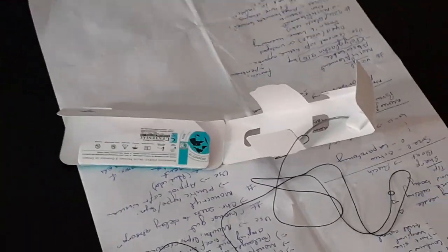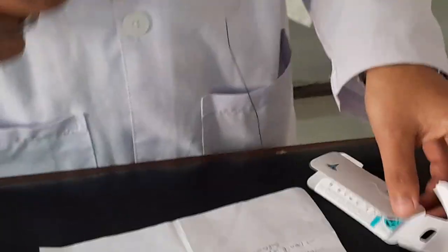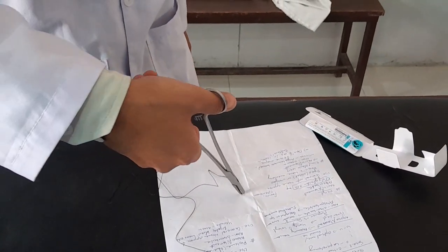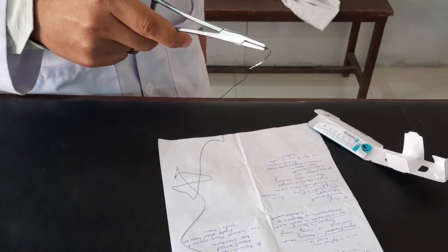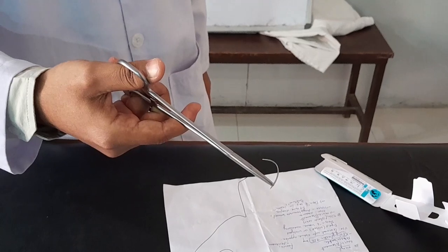Okay, we have our needle holder. We talked about it in yesterday's class also. We need to be very cautious while taking the needle out. Now you can see here I will be placing it here. Suppose we are transferring the needle, then it is better not to hold it at the tip, because the tip of the needle may break and then it can fall down into the surgical field itself.